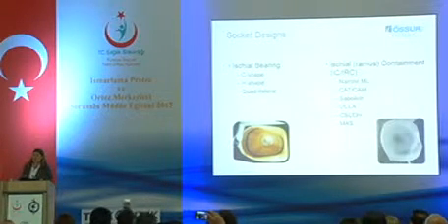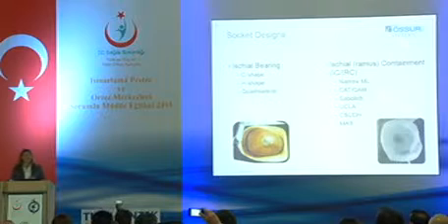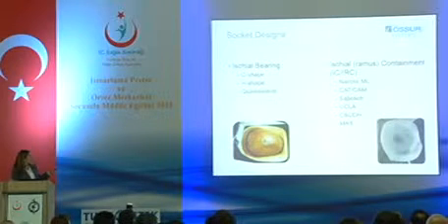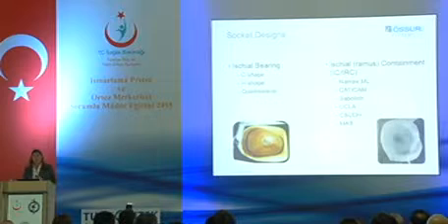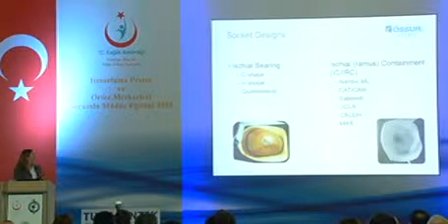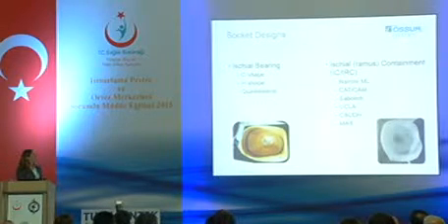So the two main socket types I think that we all know and use commonly is the ischial bearing, so something like the C shape, the H shape, which are more older types of sockets, but more commonly the quadrilateral socket. And then of course we have the ischial containment or ischial ramus containment with lots of different types of designs.